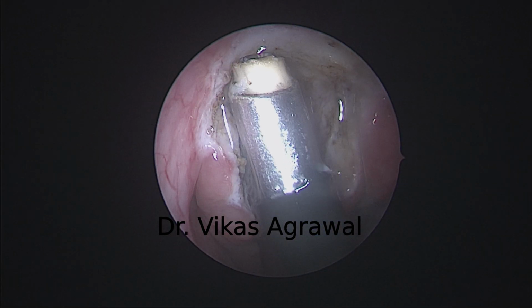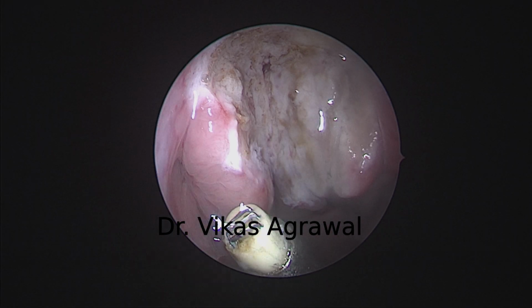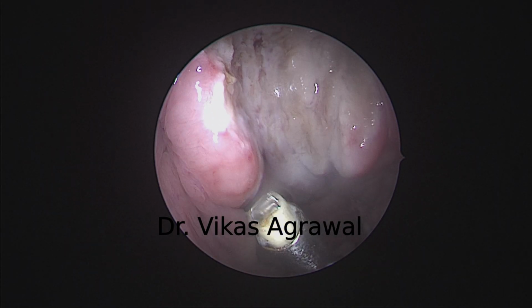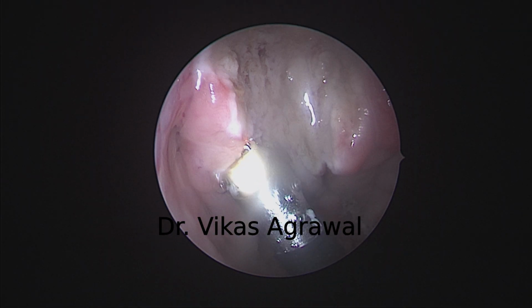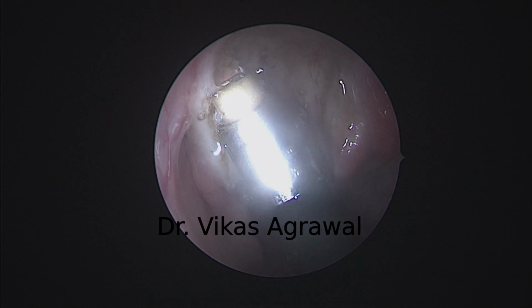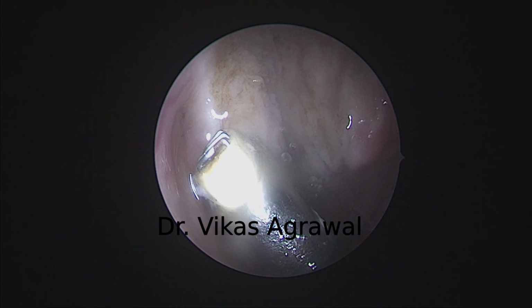Which is the periosteum below the sphenoid bone. Now this is the eustachian tube orifice. The lateral boundary of the adenoid, anteriorly, is the torus tubarius. This is the torus tubarius, and you can see a lot of lymphoid tissues on it, which I am removing, remaining 4 to 5 millimeter away from the eustachian tube orifice. Can you see this?